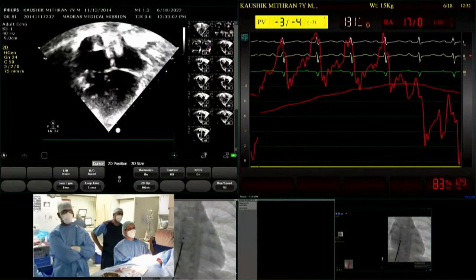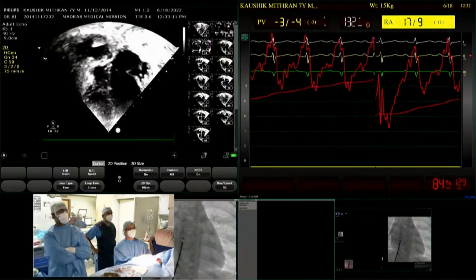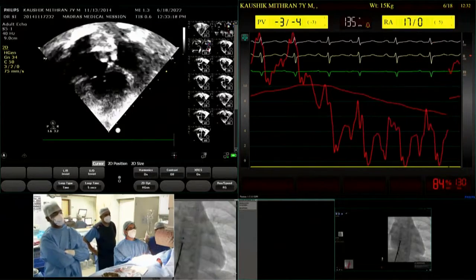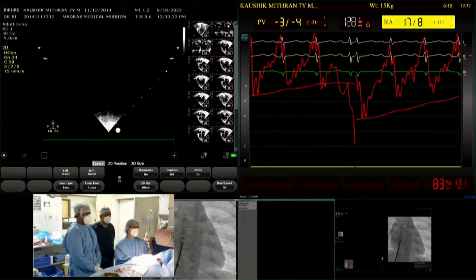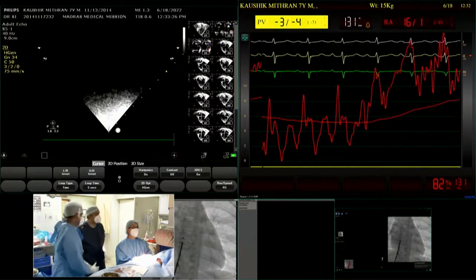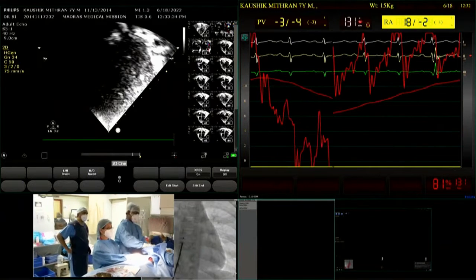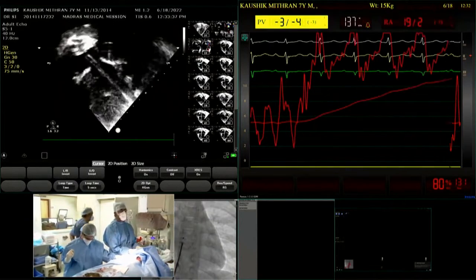So suppose imagine a hypothetical situation. We closed the device. Then what are the consequences? The consequences may be the child may develop puffiness of face, progressively some edema and all. So anyway, in these cases, you are thinking to do 1.5 ventricular repair. That is a Glenn and leave the antegrade flow there, IVC, and close the ASD. So now you are staging it. You are closing the ASD and then probably you can consider Glenn also.